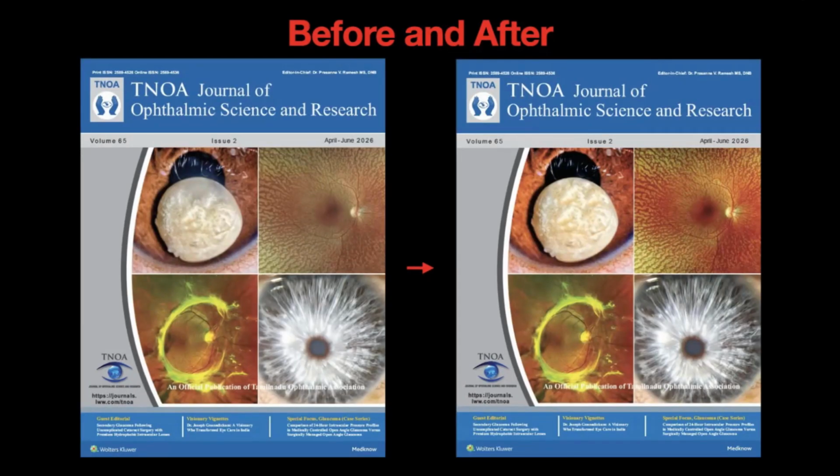Again, this is another image, from the April, May, June issue, where you can see this is unedited and this is the edited one. It looks the same, but with inquisitiveness, if you are able to pick up, you can see that some of the reflections, especially the edges of the reflections here, are not here. It makes the pupil appear slightly darker. On a cover, these are small blemishes.